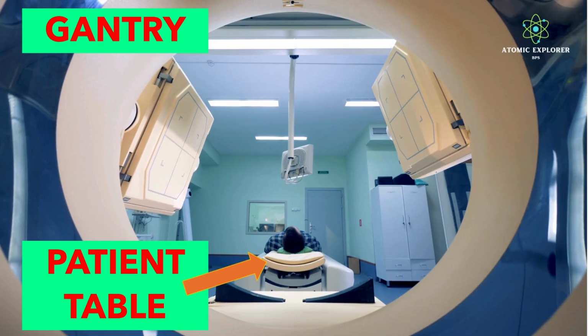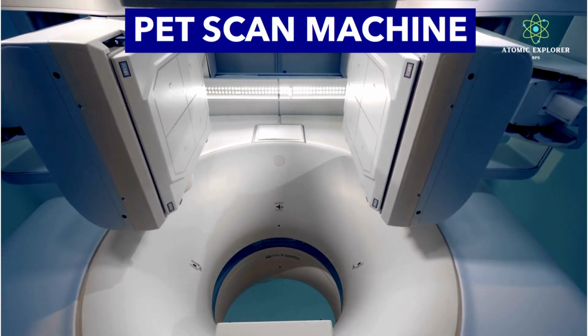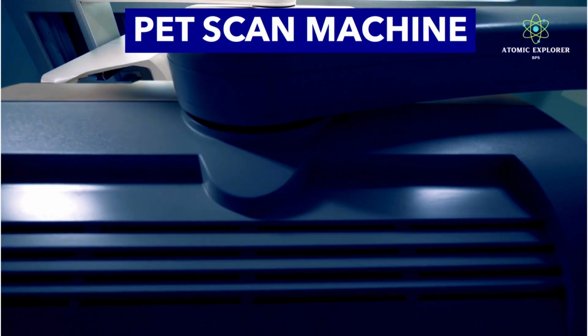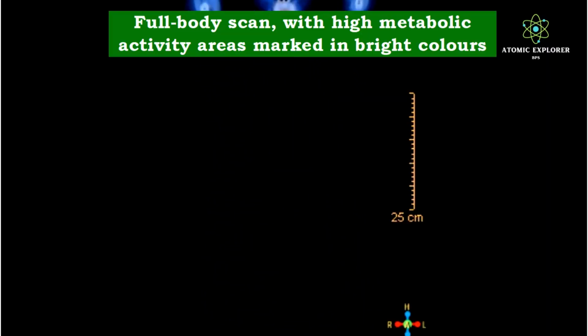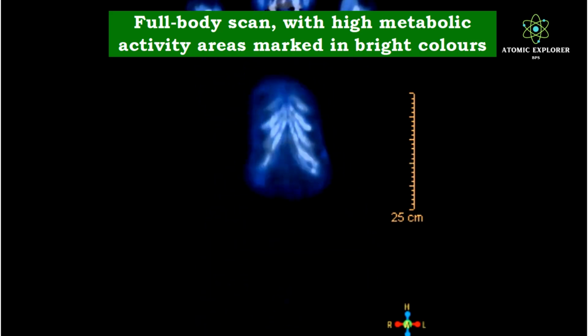The patient lies on this table during the scan. The detectors are crucial as they detect the gamma radiations emitted from the tracer within the patient's body. This setup allows for the precise imaging of metabolic processes, giving doctors a detailed view of what is happening inside the body.